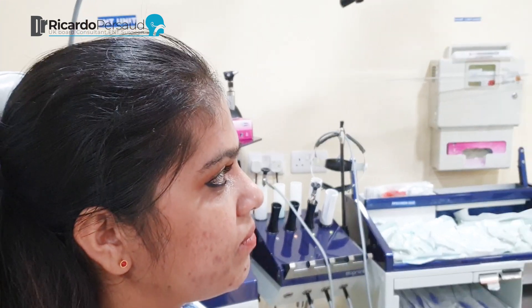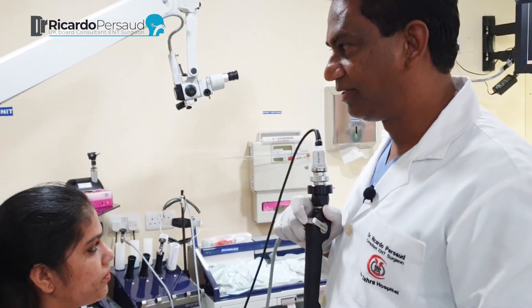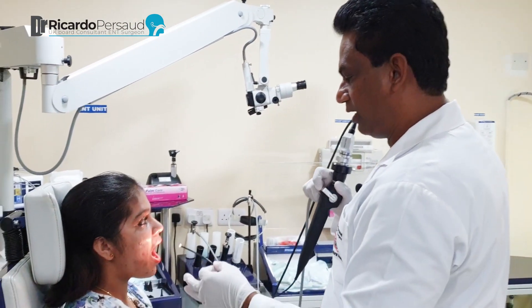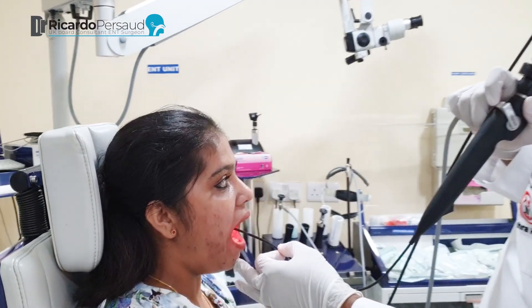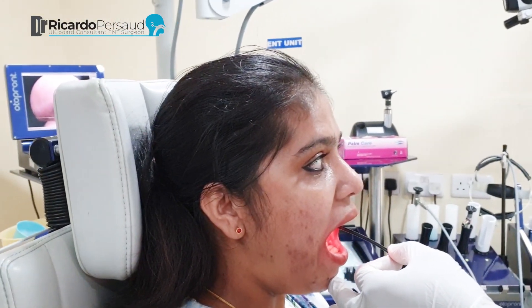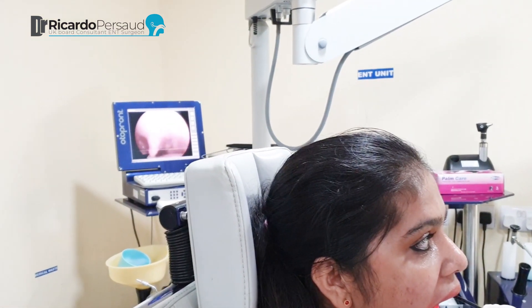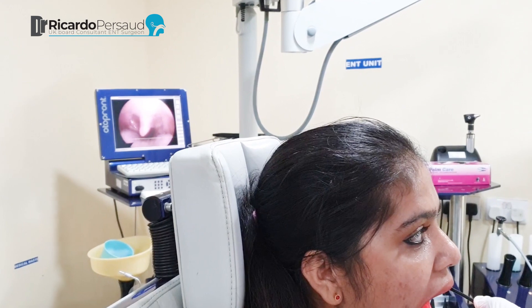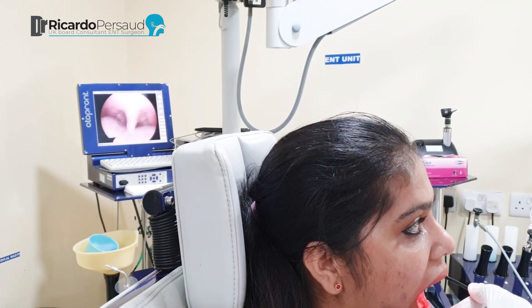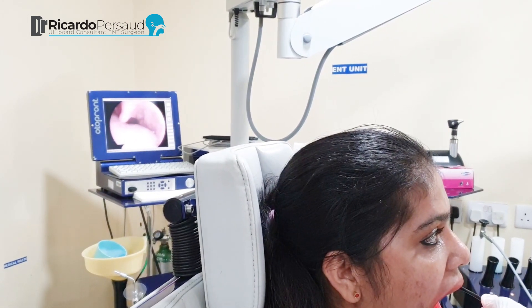Now we also need to take the swab from inside the mouth. So I'll show you the relevant anatomy inside the mouth for the test. Just open your mouth. If you go to the back of the throat, you find the uvula there, and to the sides you can see the tonsils — that's one tonsil there and that's another tonsil there. That's the area you want to swab in order to get a proper swab. So: uvula, the side of the uvula, side of uvula where the tonsil is located.